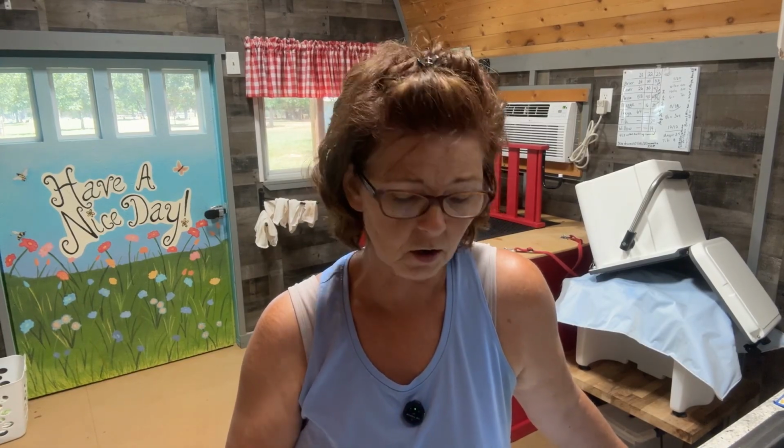So I did do a bacteria count on her milk individually, and it was perfectly fine. She had no coliforms and 10 colony forming units on her standard plate count. So that is nothing to be concerned about at all. So I don't think there's anything going on, but what the heck? I'm going to give this a whirl. Let's do this test together.